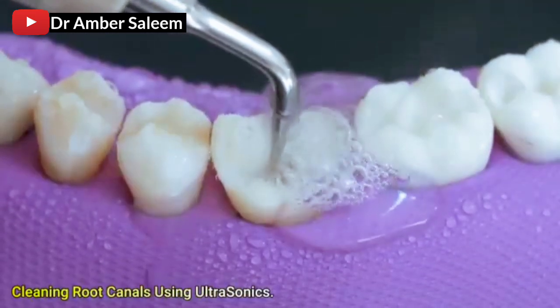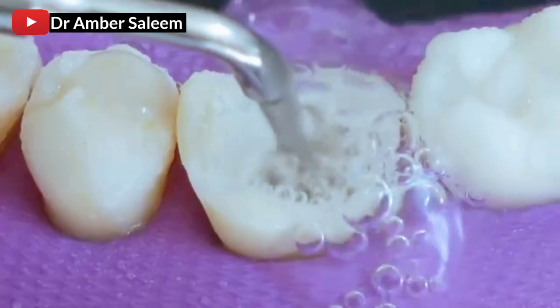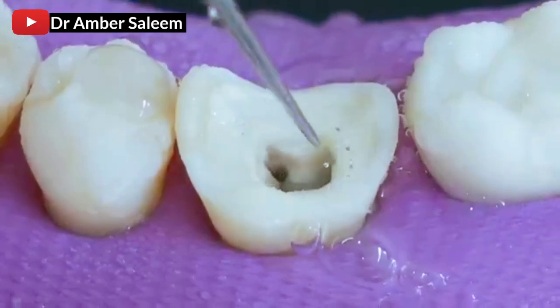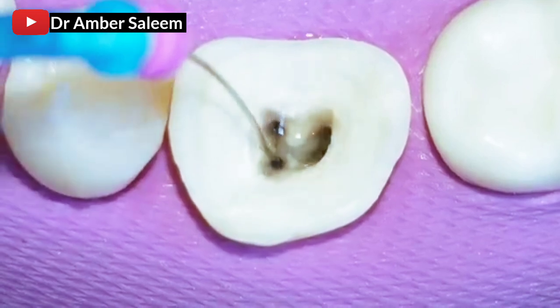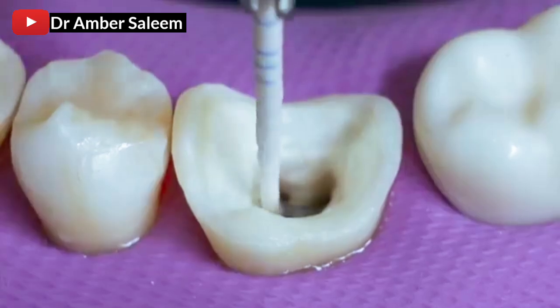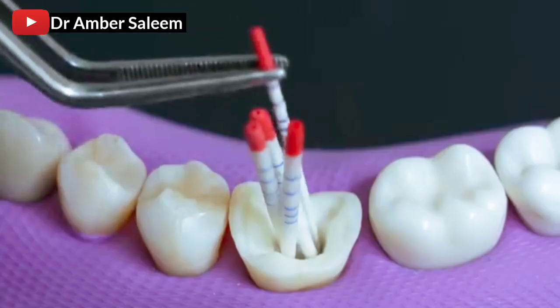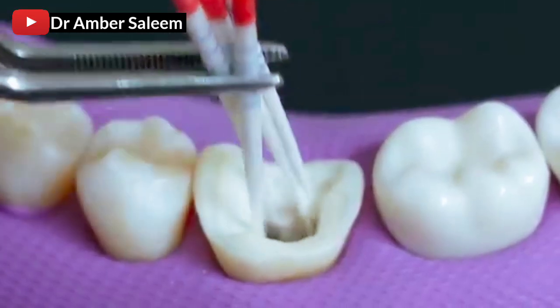Cleaning root canals using ultrasonics. Drying root canals with absorbent points. Filling root canals with gutta-percha.